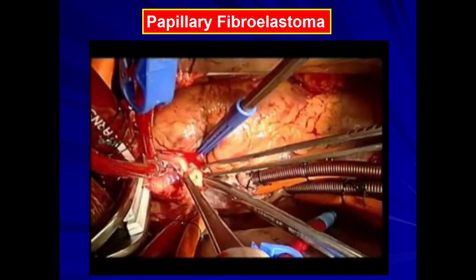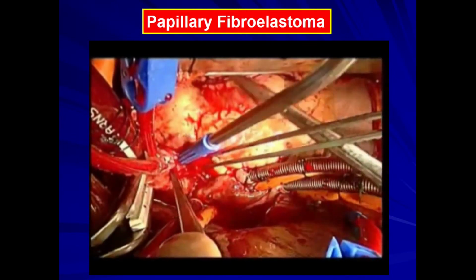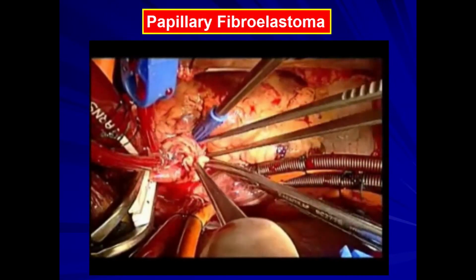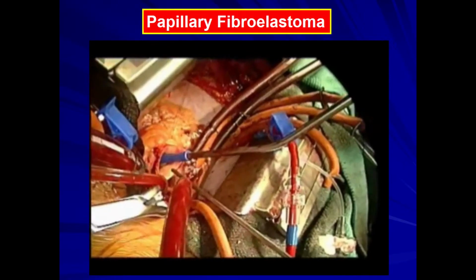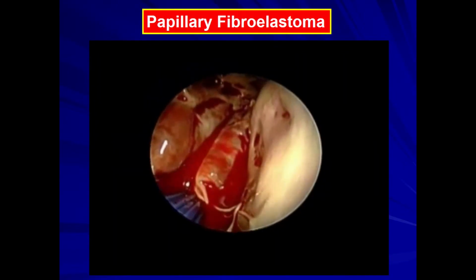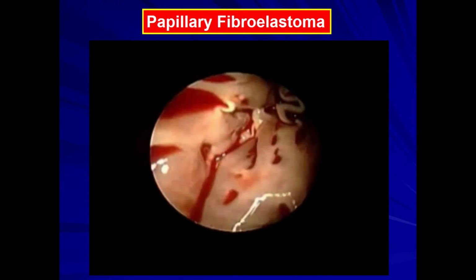So she subsequently underwent surgical removal of this, again, because it was a very atypical presentation, and the clinical scenario did not help us. Further imaging did not help us in this particular case. These are the intra-op views where the surgeon is literally now inside the heart, inside the left ventricle.